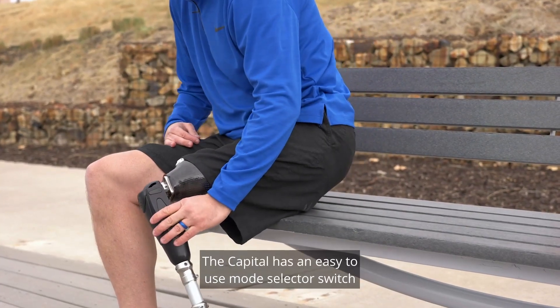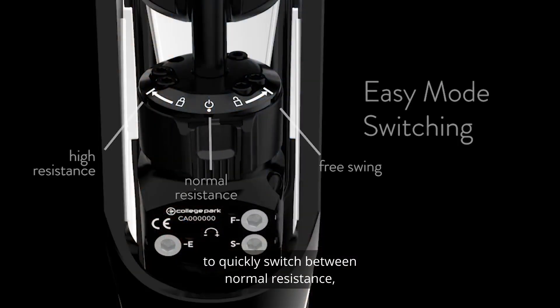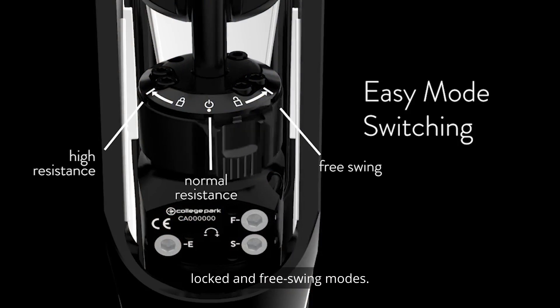The Capital has an easy-to-use mode selector switch on the back of the device that allows the user to quickly switch between normal resistance, locked, and free swing modes.